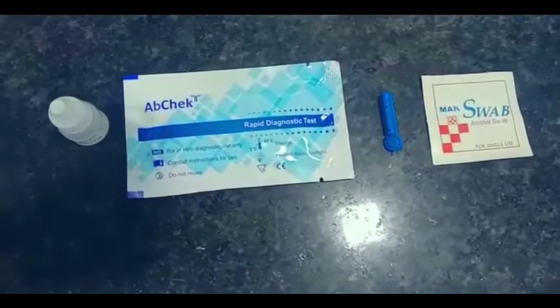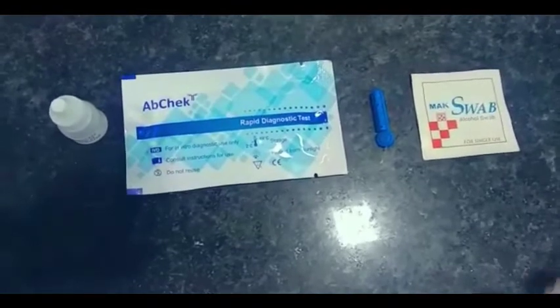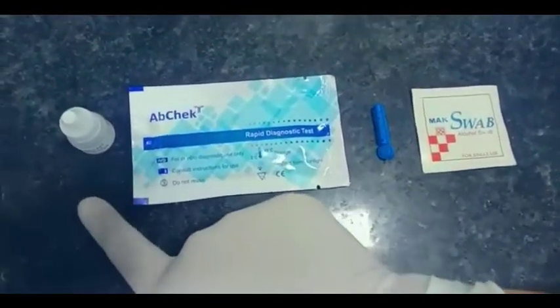Of the COVID-19 IgG-IgM antibody rapid test kit. We require an alcohol swab, 1 lancet, 1 cassette, and assay buffer. Wipe the finger with the help of the alcohol swab.